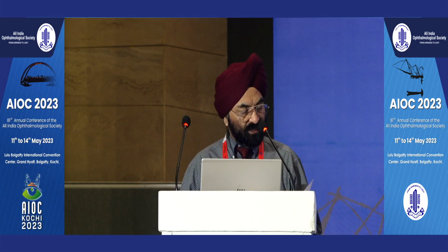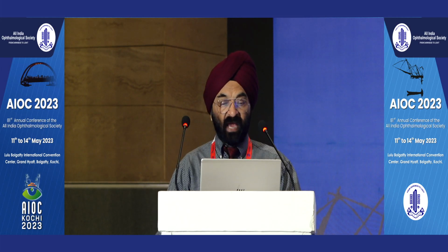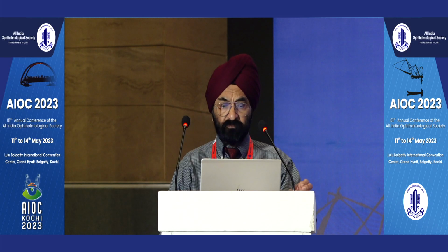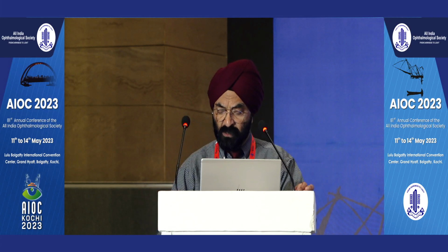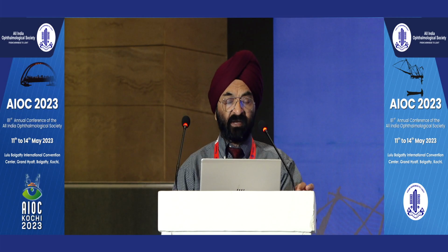So we begin the session, and I'm going to cover perfect biometry. Can we better it? We all know that cataract surgery is now a refractive surgery, and in earlier times, cataract was removed first and spectacle prescription given last. But today we calculate power of IOL first, and cataract surgery is done afterwards. So IOL calculation plays a very important role to determine refractive outcome after the cataract surgery.